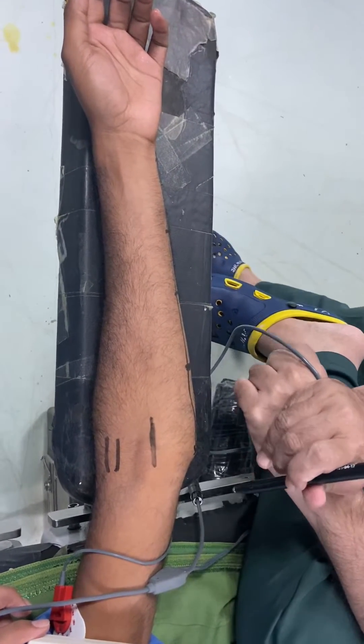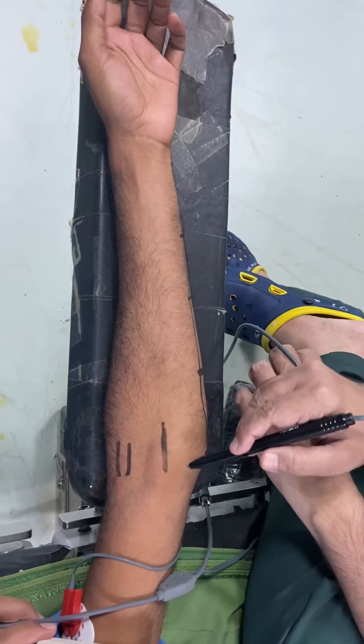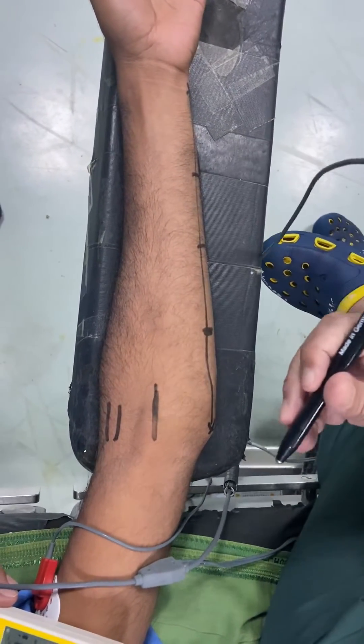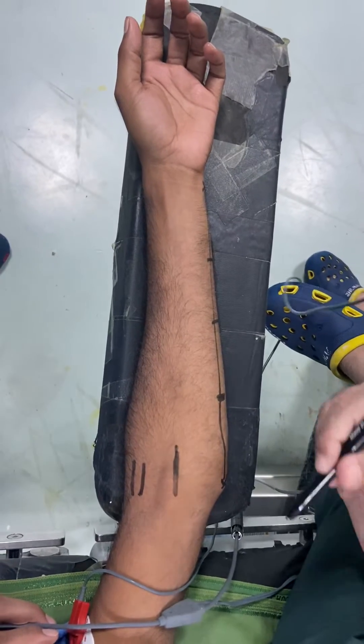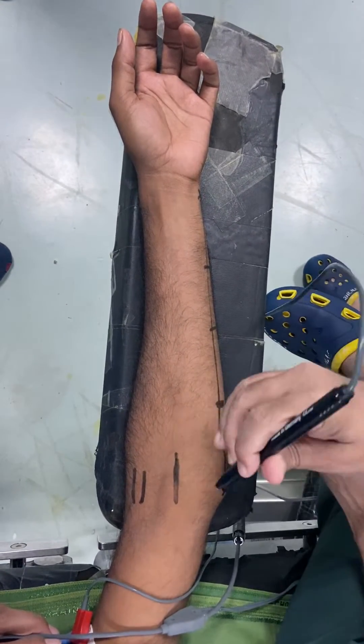Good morning friends. This is to demonstrate how to give distal nerve block with PNS. This is just a demonstration in a volunteer, Mr. Ashok, our OT assistant, who has volunteered to demonstrate this block.